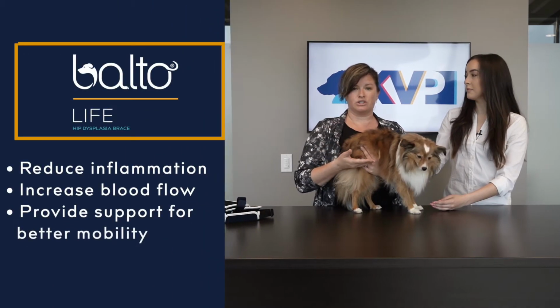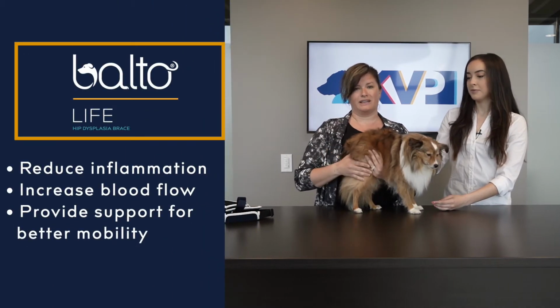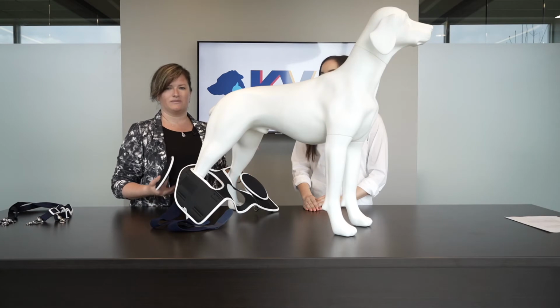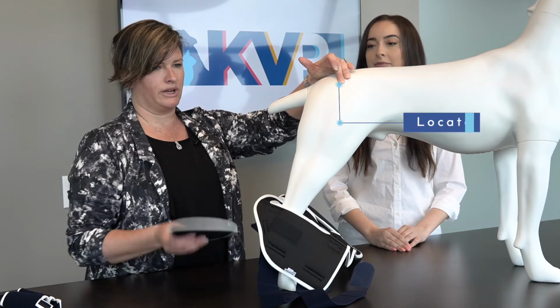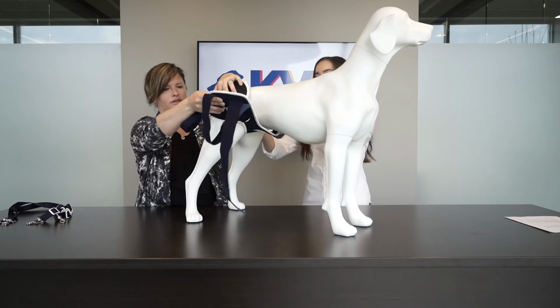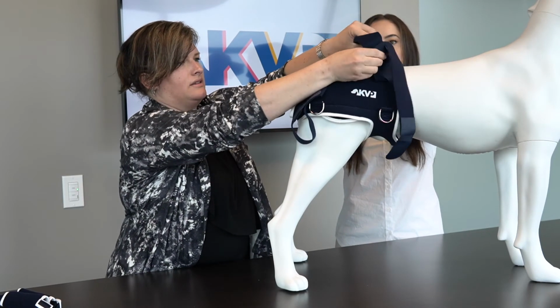That does a couple of things for you. You're going to reduce inflammation, you're going to increase blood flow, and give them the support they need so that they have better mobility. So during application of the Life brace, you want to grab an extra pair of hands, either a technician in the clinic or a family member at home. Again, you're going to palpate for that point of the hip, the greater trochanter, so you can center the disc. You're going to have your patient standing in the brace and then help lift it up to secure that Velcro, and then you're going to secure the Velcro straps up over the hips.